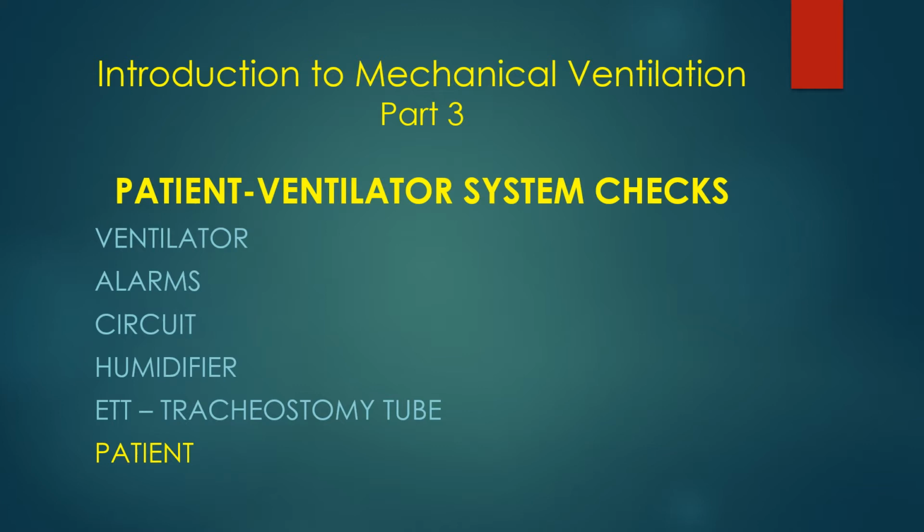So the respiratory therapist is going to check also the alarms on the machine, making sure the alarms are set appropriately so the patient is protected in case there's any condition that might cause harm to the patient, or to alert you that some change has occurred in the patient.